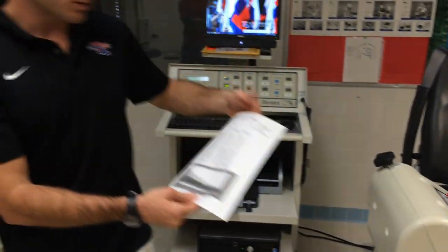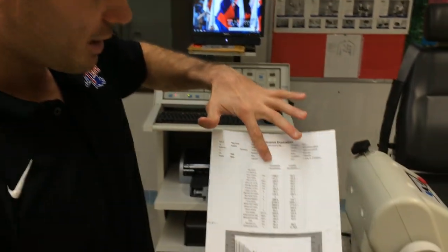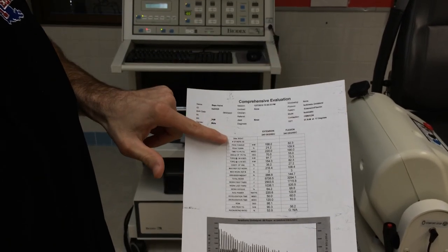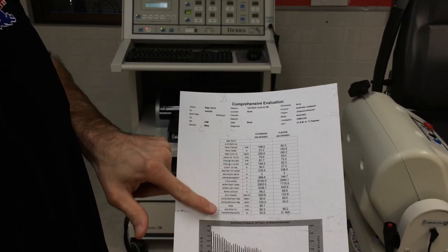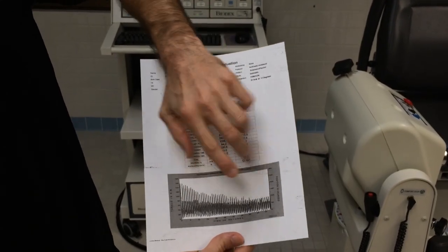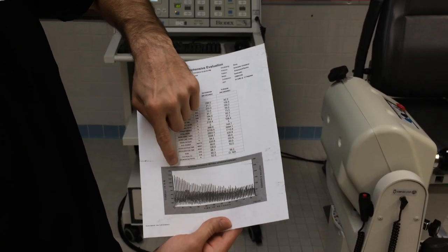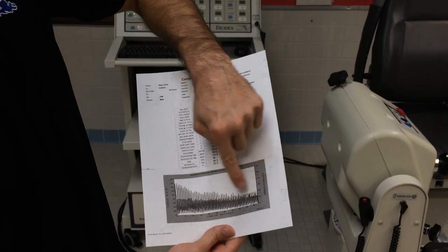And what we can see on the report is it'll give us all his repetitions for both the extension and the flexion portion of the test. It'll give us things such as peak torque, relative peak torque, total work, things like that. It'll also give us a nice graph where we can see he had a nice fatigue. If you do a test and it was reversed, if it started low and ended high, something's gone wrong. Over time, we should see his torque start to decrease as he gets tired.